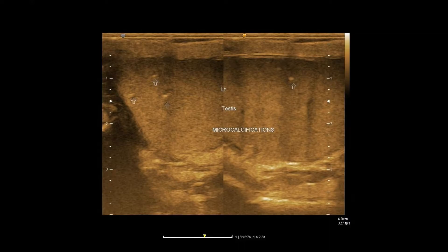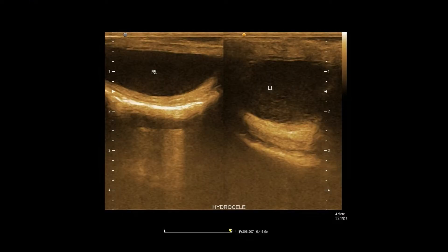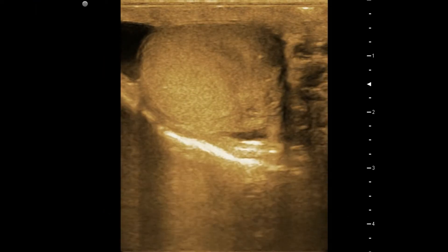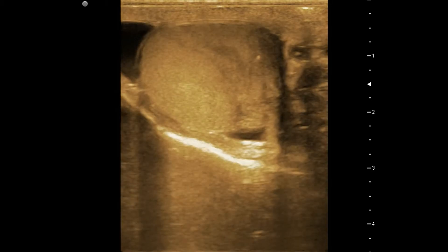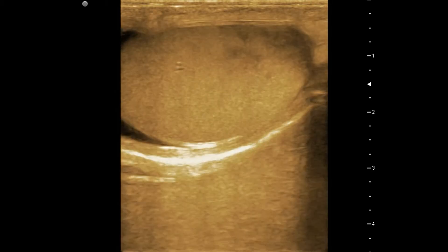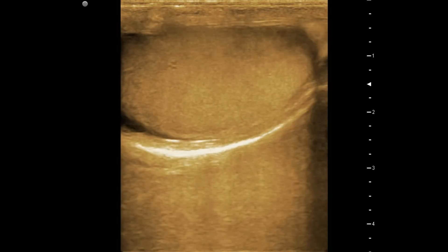In this picture, microcalcifications are well visualized. This image shows bilateral hydrocele. Now let's see on real time. Check the focal hypoechoic change with microcalcifications from different views.